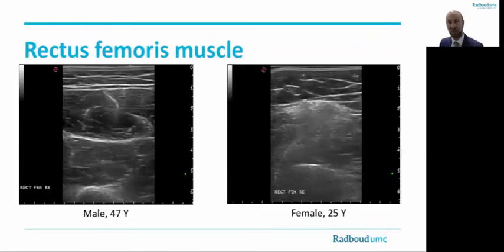Let's continue with two case examples. On the left side we see a muscle ultrasound image of the rectus femoris in a 47-year-old male, and on the right side we see the rectus femoris in a 25-year-old female. The muscle on the left has a rather normal visual appearance, whereas the muscle on the right has quite an abnormal appearance with high echogenicity and loss of normal muscle architecture. Both patients are known with facioscapulohumeral dystrophy, and these cases illustrate the high variability of muscle involvement in this specific disease.